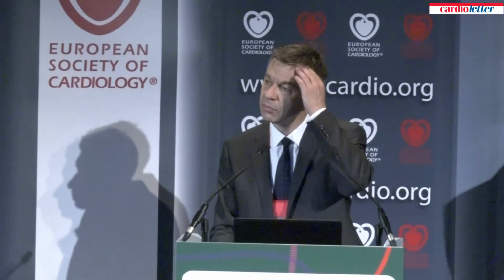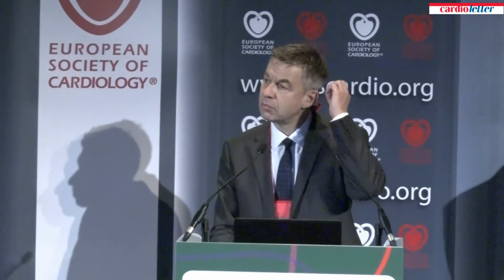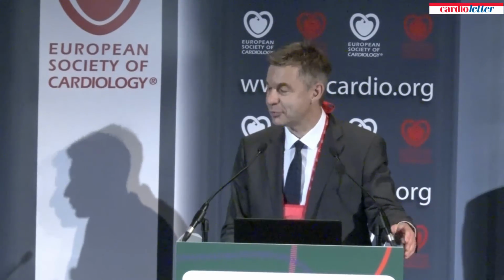But in view of the study design, it's likely that there is potential to reduce the number of OCT runs and therefore the volume of contrast medium and the radiation exposure. But this has to be assessed in another clinical study. But the degree of FFR value gained would be worth that additional risk? Yeah. Well, I don't know. Okay.